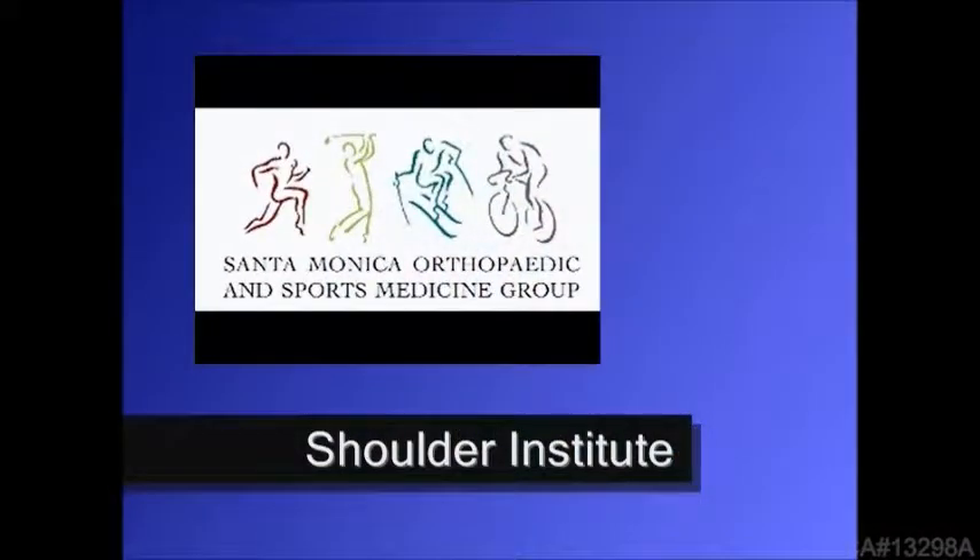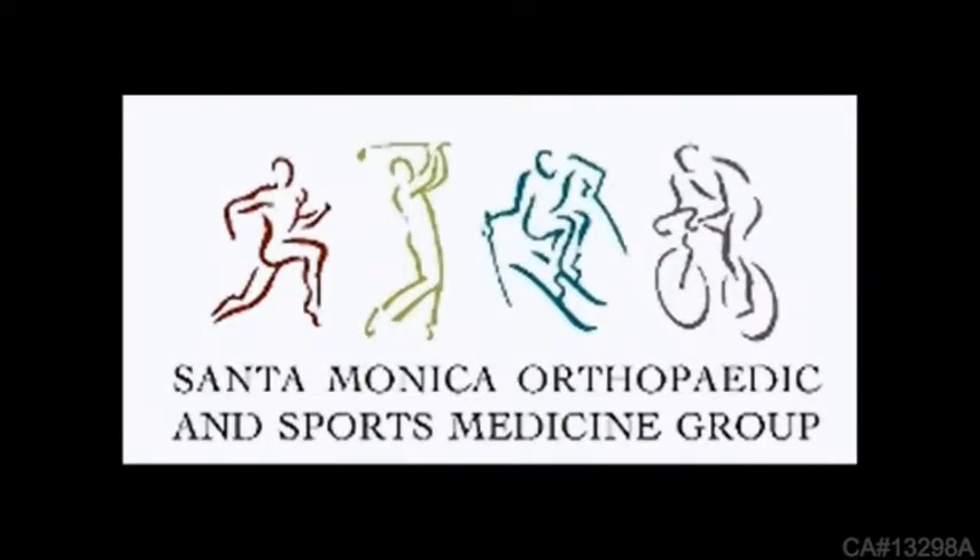Santa Monica Orthopedic and Sports Medicine Group Shoulder Institute presents Arthroscopic Superscapular Nerve Release, presented by Thomas P. Knapp, MD.